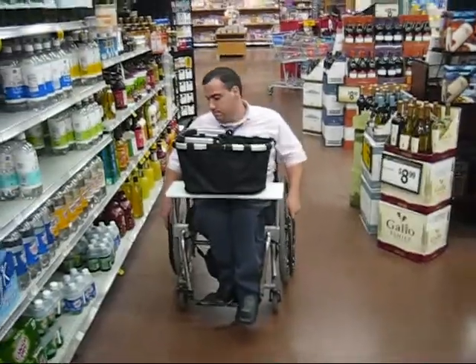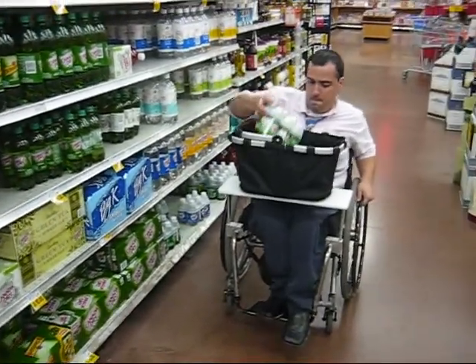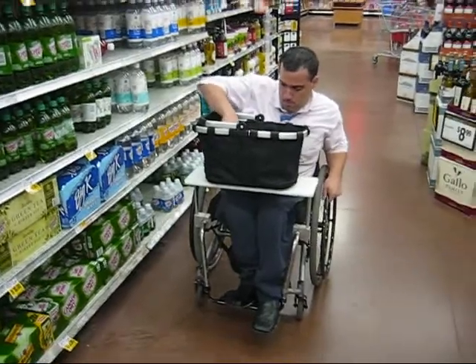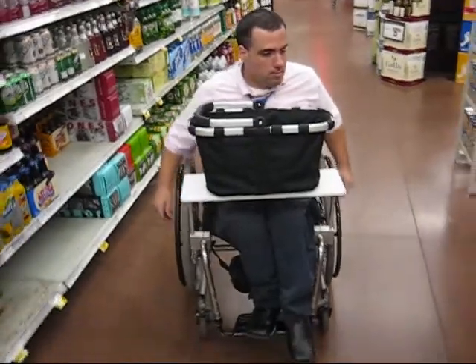During shopping, the client does not experience any limit to mobility to his side, so that he can freely choose the items that he needs. There is also no interference with the wheeling of the chair, so that the device allows the client to go shopping independently.